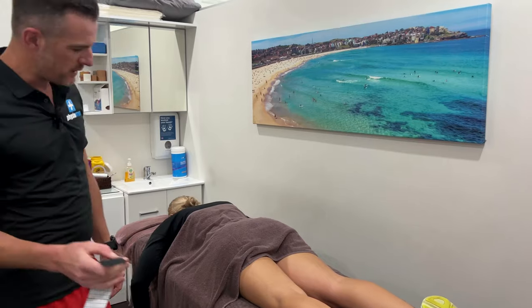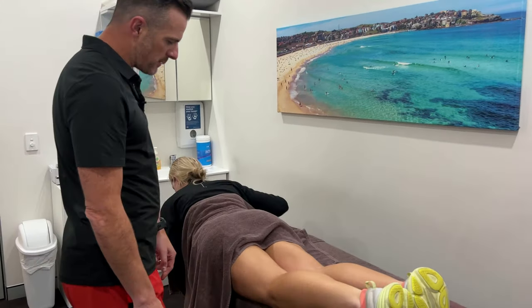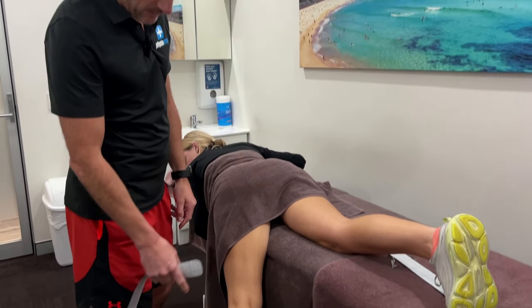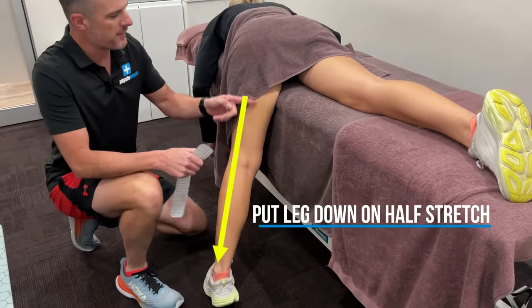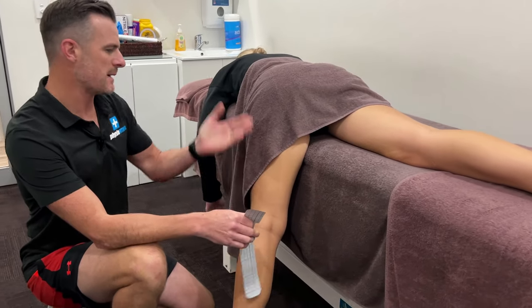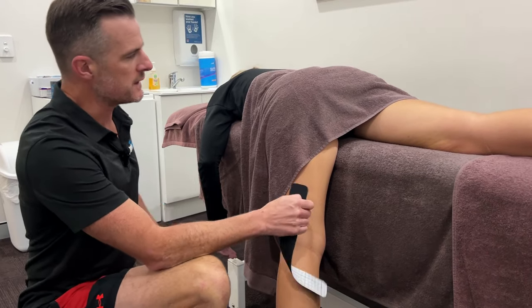What you need to do is put them on stretch. Before you get them off the bed, just come to the side — they need to bring the leg off the bed, and it needs to be high enough that they put their foot on the ground. You really want to think about this: this is not the hamstring on full stretch. Think of that as like mid-range stretch. The best thing is when that muscle is on stretch.